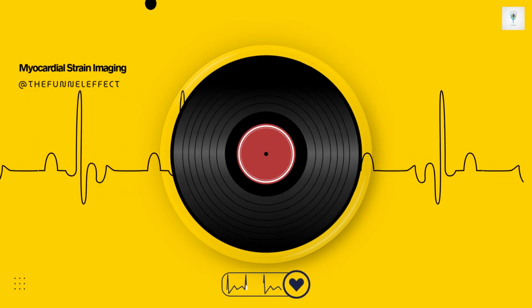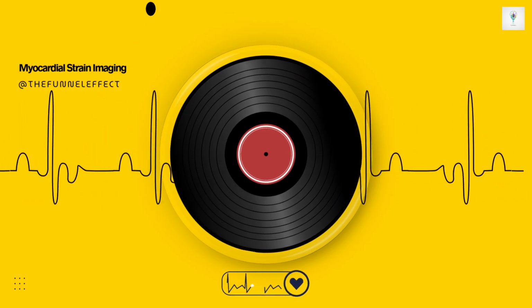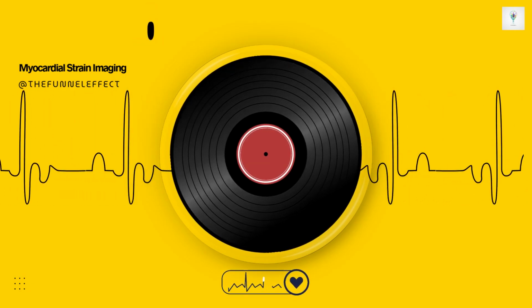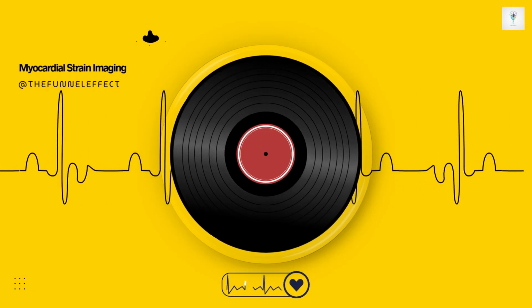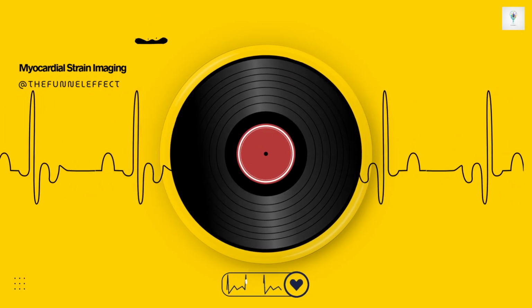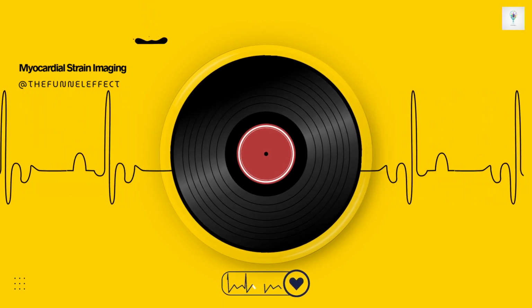Okay, let's pivot now to the technique most clinicians use day in, day out, echocardiography or ultrasound. What was the first echo method for strain? The first attempt was tissue Doppler imaging, or TDI. This was basically a one-dimensional technique that measured the velocity of the tissue movement, not deformation directly, but you could derive strain rate from it.